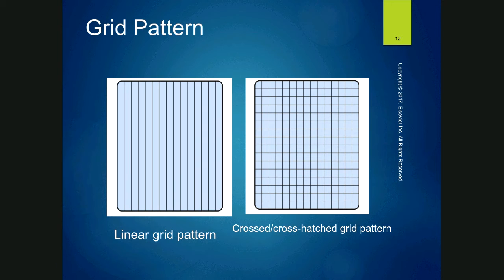Linear grids, crosshatched. Trying to make sure I'm not forgetting anything. I probably am, but I can't remember.